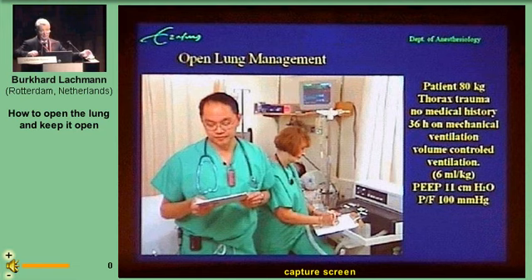Okay. He's a 42-year-old male, 80 kilos, severe trauma to the thorax, and today's the second day on mechanical ventilation. Right now he's on volume control with a PEEP of 11 centimeters of water, plateau pressure 26, and his respiratory rate is 32. Tidal volume is about 480. That's 6 cc's per kilo. His I/E ratio is 1:2. And since the slide this morning, we had to go up on his FiO2 to 70%.